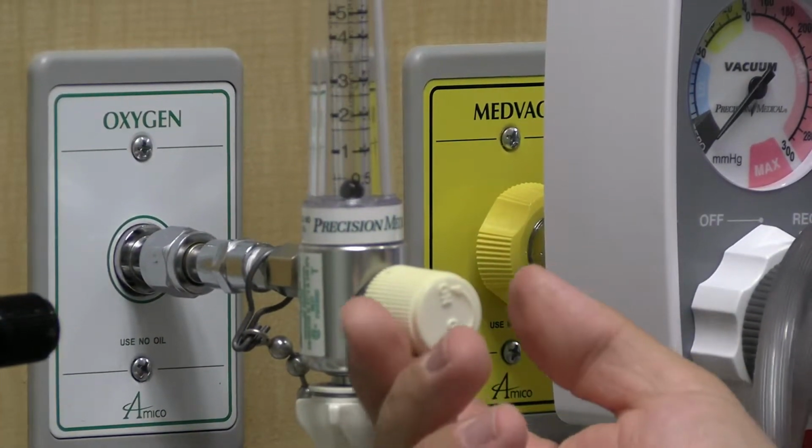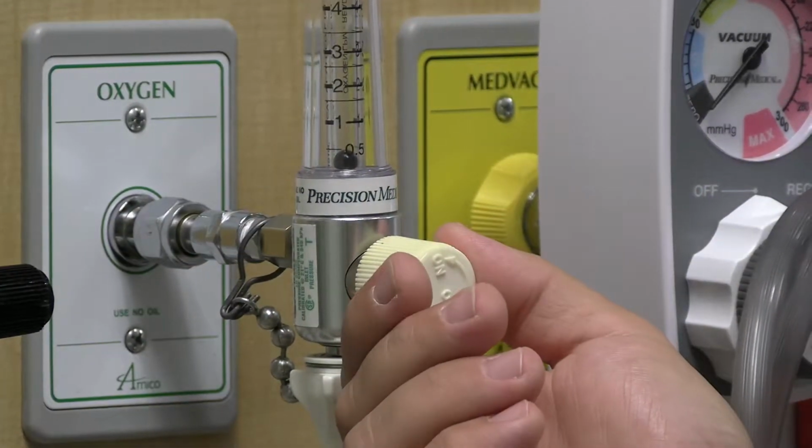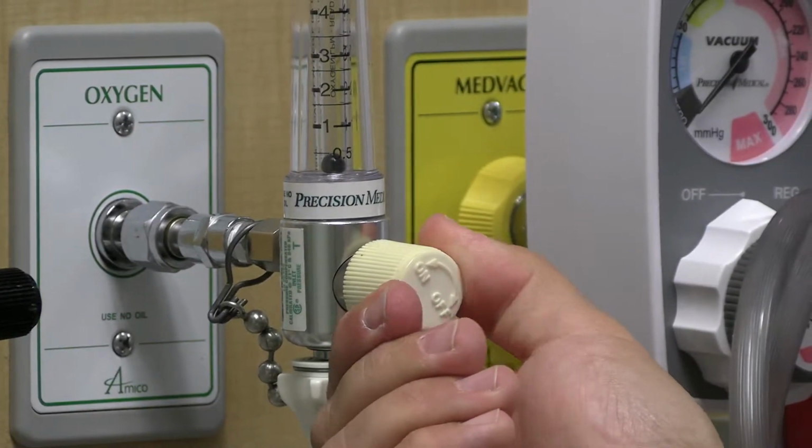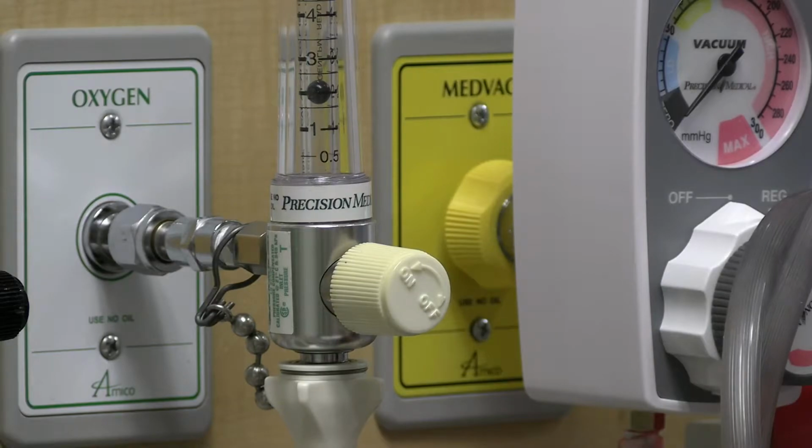You then are going to turn your flow meter on, and you'll see your graduations are there. So I'm going to start my therapy at 2 liters per minute. The marking should be at the halfway point of the ball.